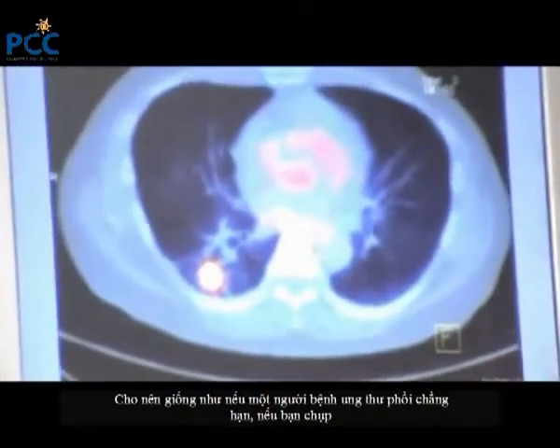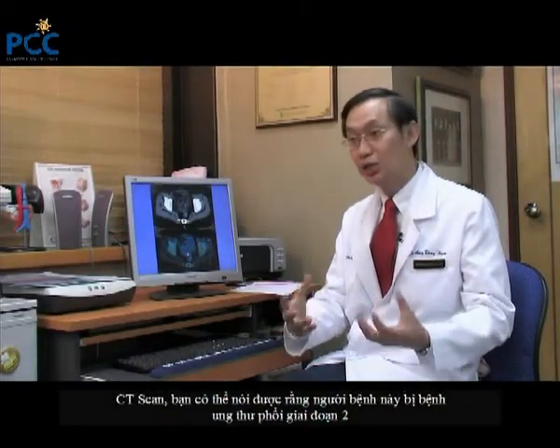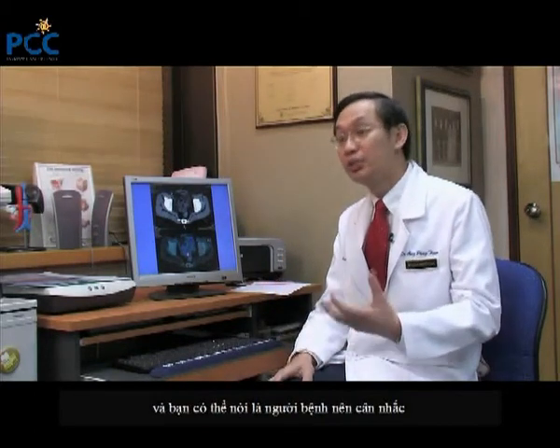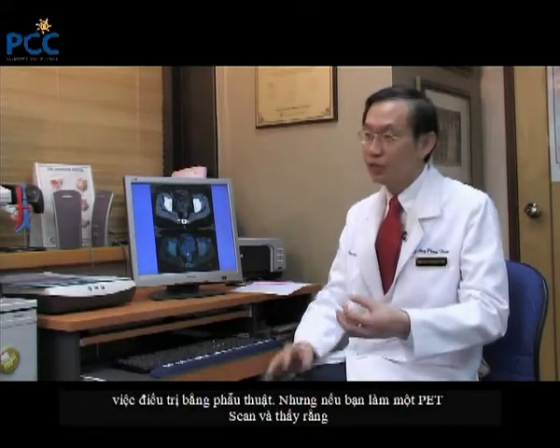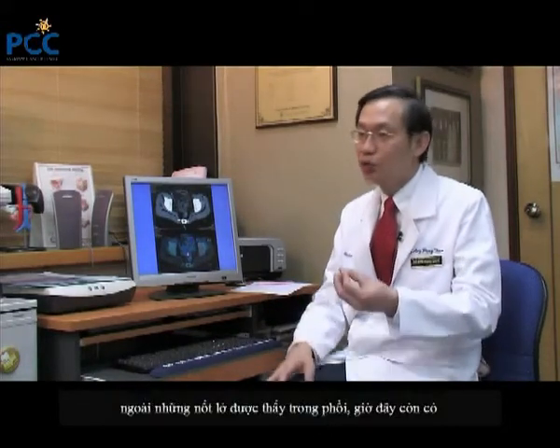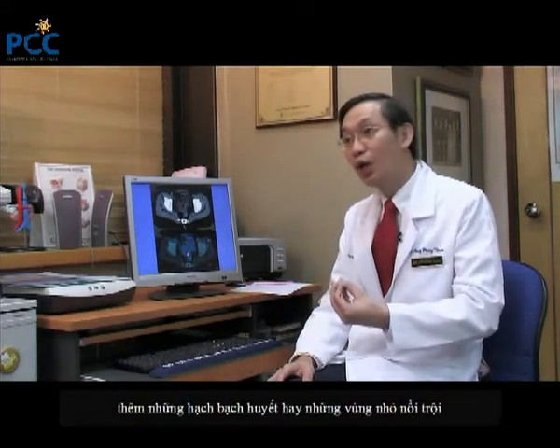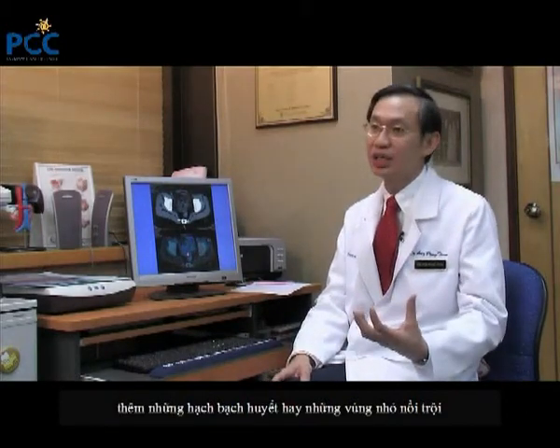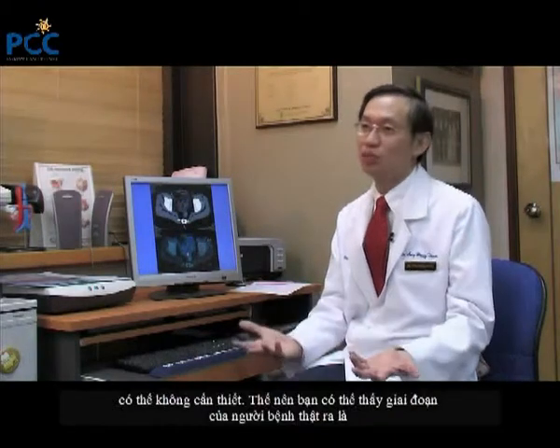So a patient who has a lung cancer, for example, if you do a CT scan, you may say, look, this patient has a stage 2 lung cancer, and you may say this patient will need to consider surgery for intervention. But if you do a PET scan and you find that besides the lesion that is seen in the lung, there are now more lymph nodes or small areas of increased uptake in the other lung or in other parts of the body, a surgery may not be necessary.